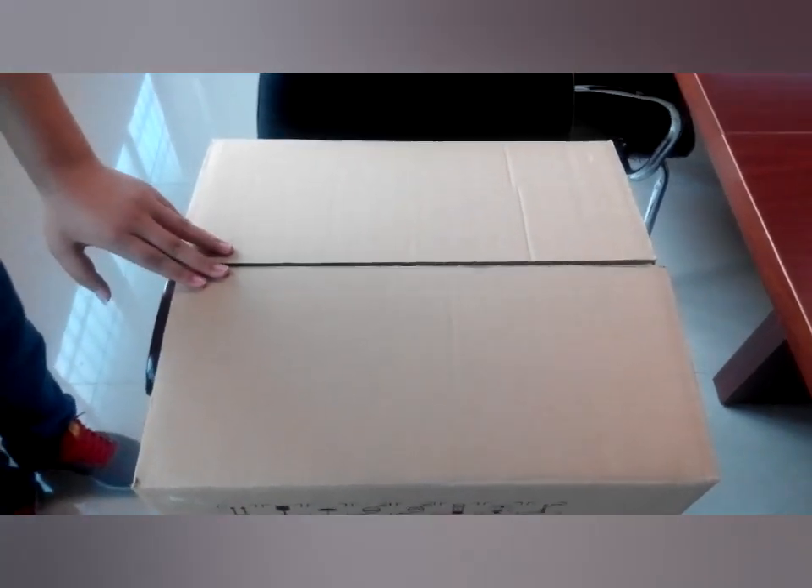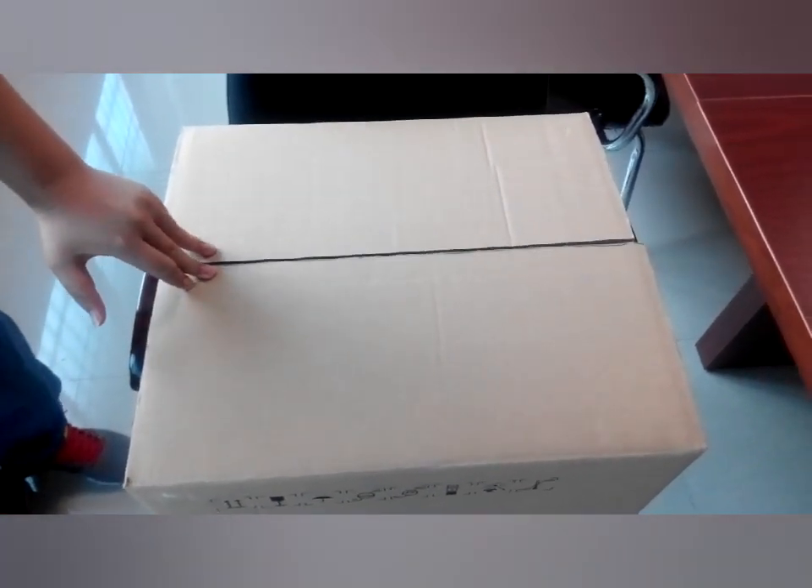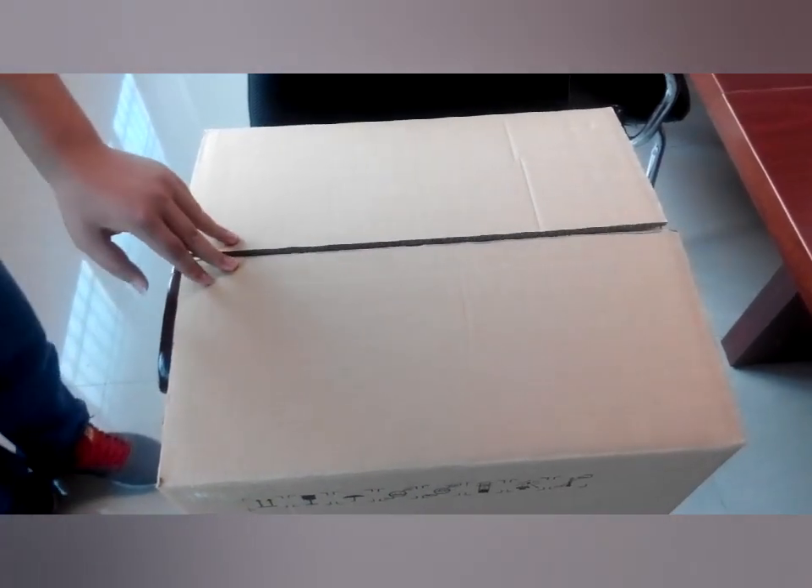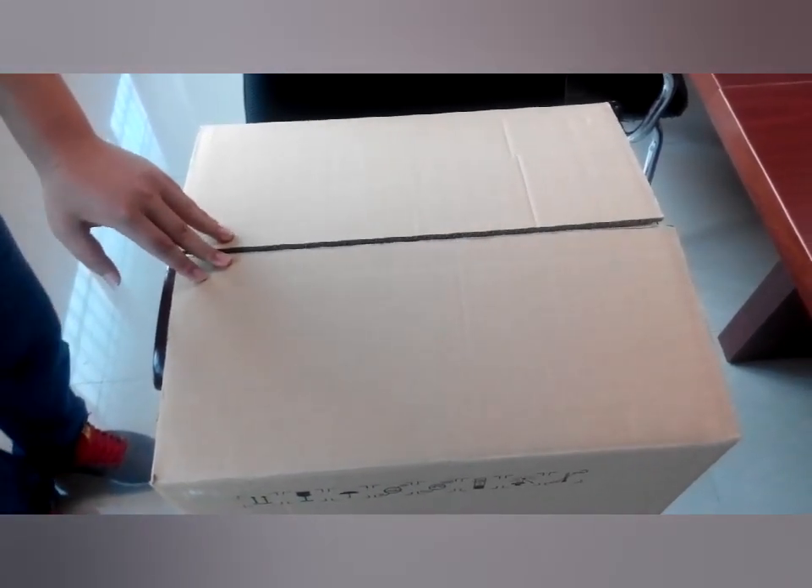Hello everyone. Thank you for your biochemistry analyzer. It's my honor to introduce how to install and how to test using this machine.